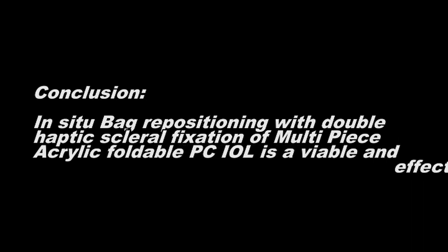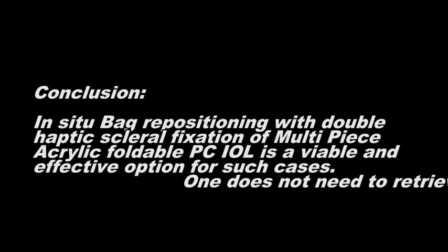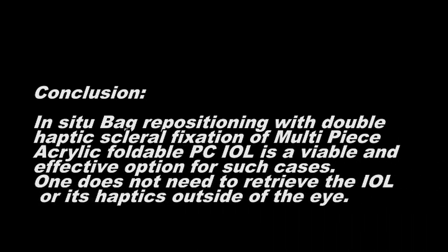Conclusion: in situ bag repositioning with double haptic scleral fixation of multi-piece acrylic foldable PCIOL is a viable and effective option for such cases. Using this technique, one does not need to retrieve the IOL or its haptics outside of the eye.